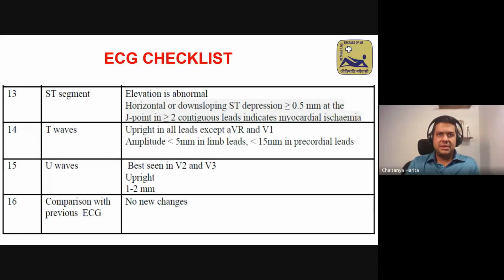Yes, a rare arrhythmia is something that you may not know. You'll at least be able to identify, is this an arrhythmia or not? I need to do this and refer the patient. But you will not miss, and especially missing an MI is definitely something that could cost the patient his heart or even his life. Right? So this checklist is something that I request all of you to follow. It's quite easy. It's made by our medicine department. So once I share the slides with you, take screenshots of these 3 slides, keep it with you. You will never miss an ECG.